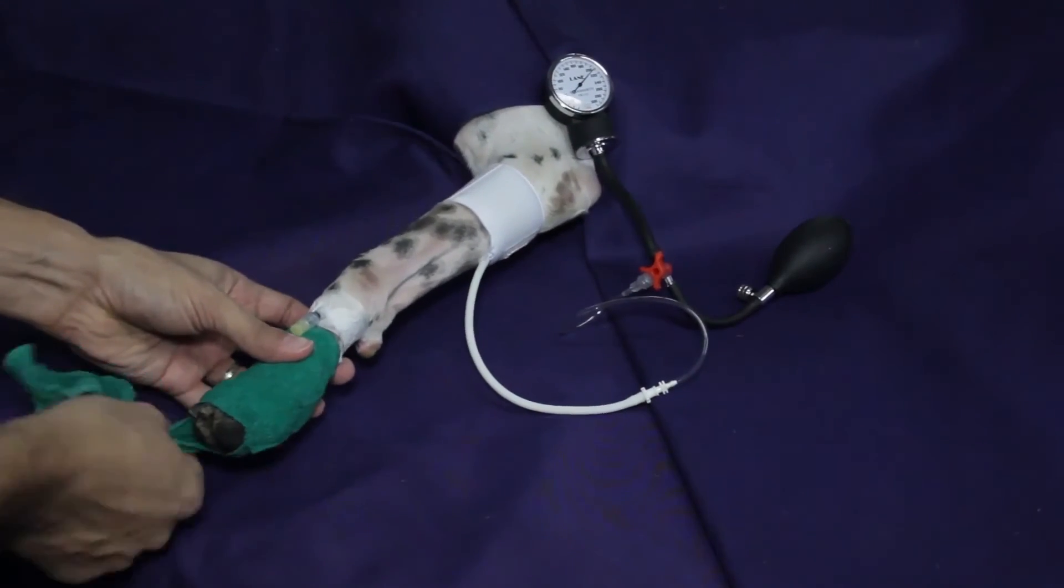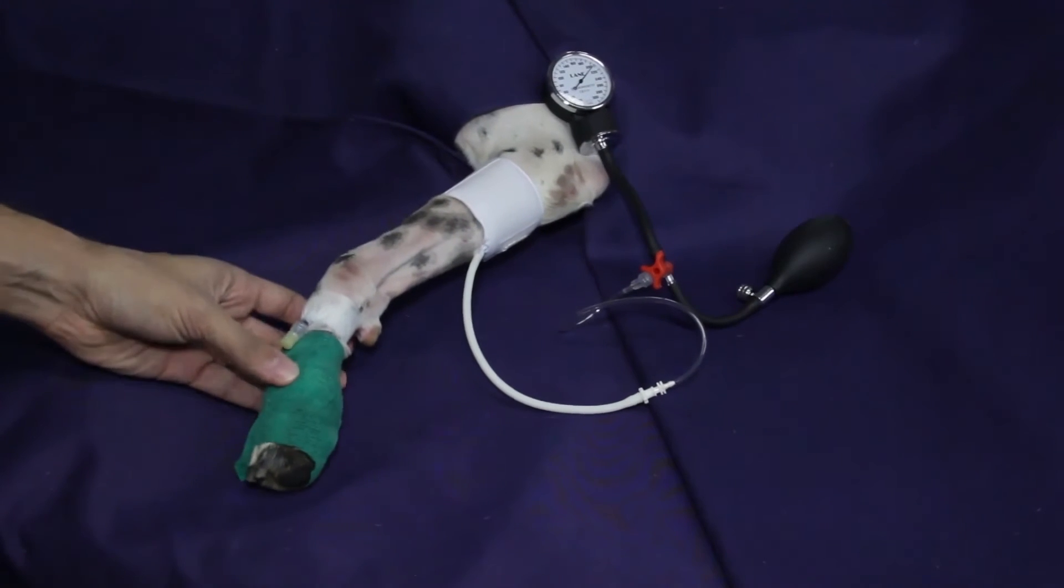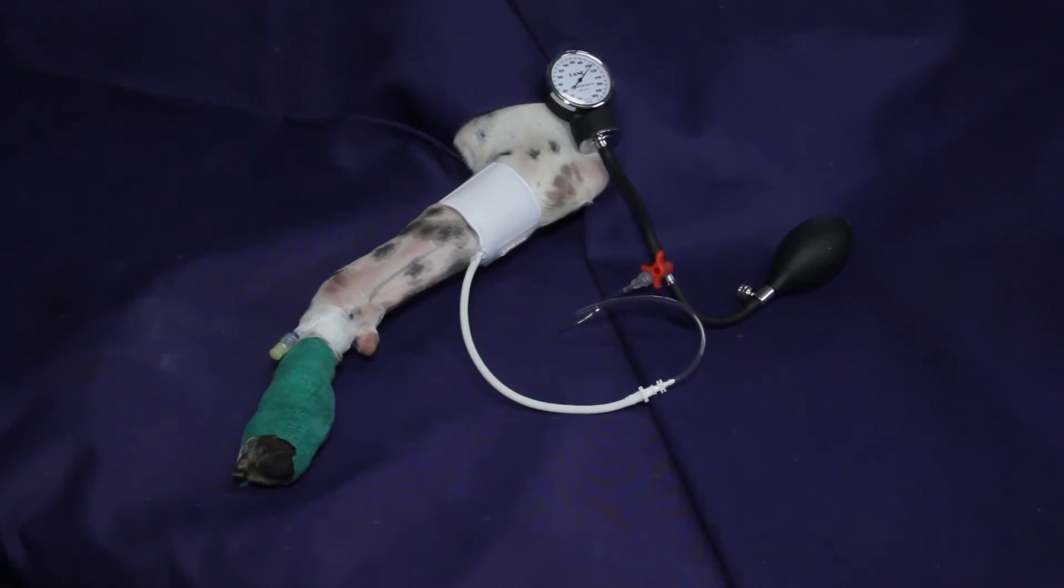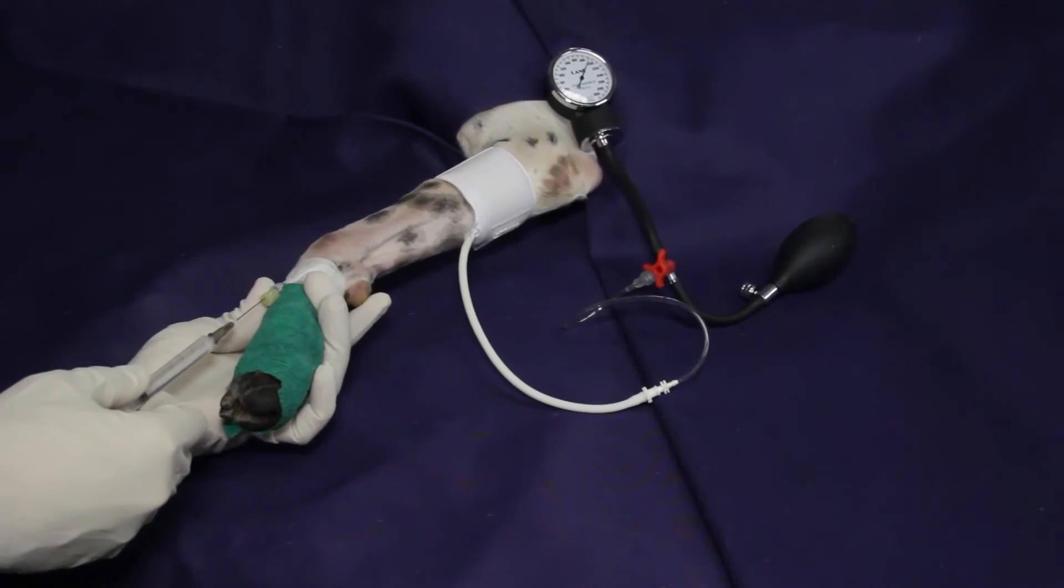Anesthesia of the limb distal to the tourniquet is achieved within 10 minutes following the injection. The tourniquet application must be restricted to less than 90 minutes to avoid tissue damage.